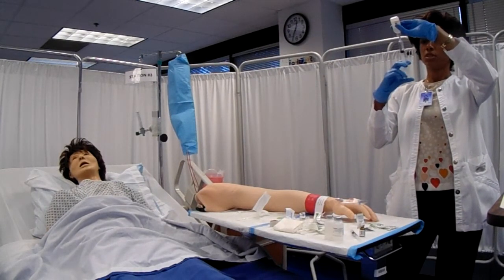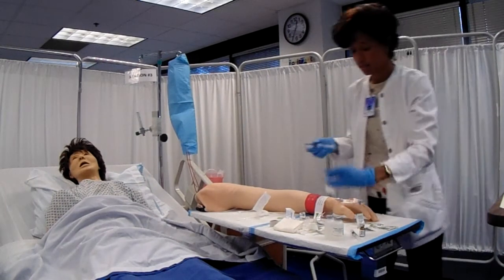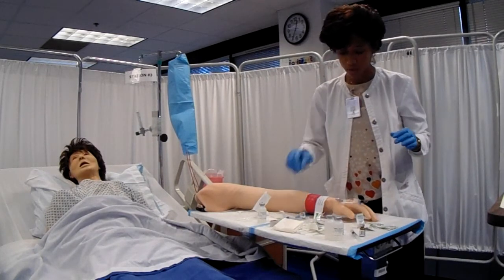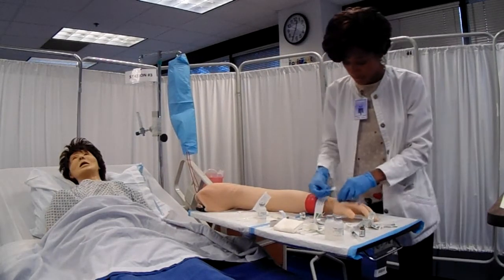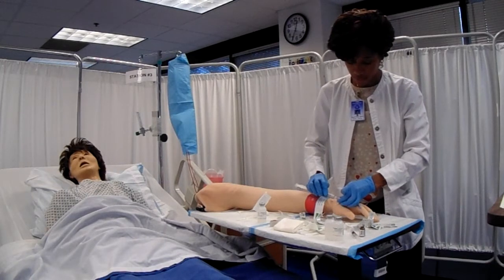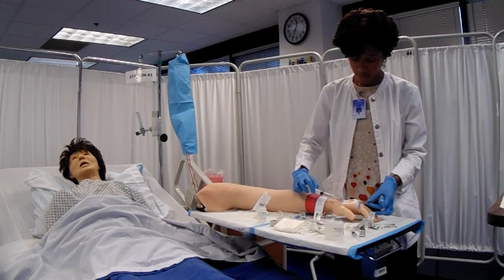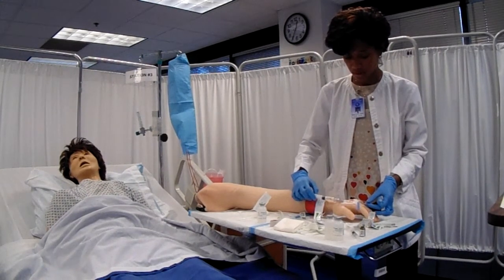And I'm going to be administering my furosemide as indicated by the drug guide at a rate of 10 milligrams over 1 minute. So first let me go ahead and scrub the hub of your IV loop. Open the site, and I'm going to go ahead and flush slowly with just about 3 cc's, 3 mLs of normal saline. How are you feeling? Okay? Great. Alright.